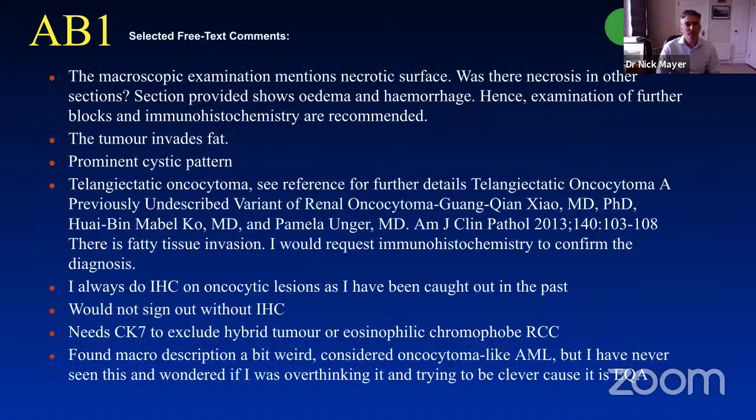In terms of the free text comments, these are very selective ones because we've got a lot of comments on this case. I've already flagged the fact that some people had noted the presence of necrosis being described macroscopically, and this was potentially of concern given the diagnosis they might make. A lot of people commented on perinephric fat invasion, that the tumour had quite a prominent cystic pattern, and some people went further to subtype this as the telangiectatic variant of an oncocytoma.